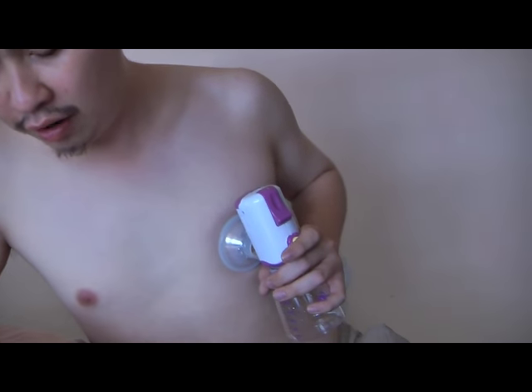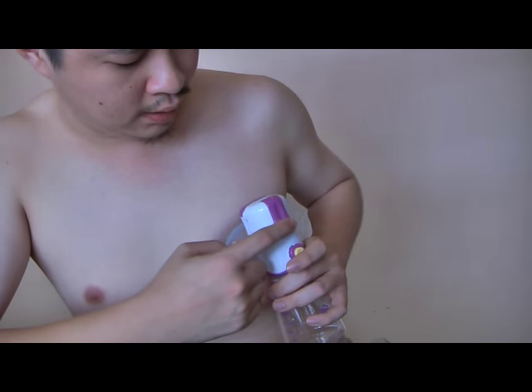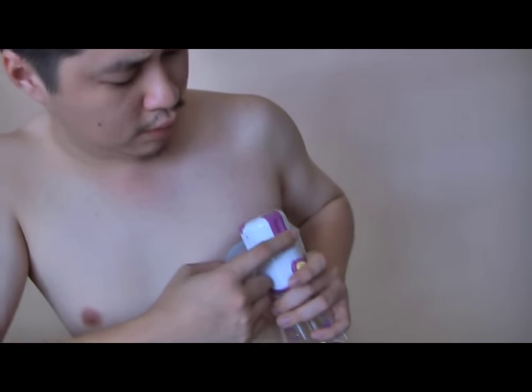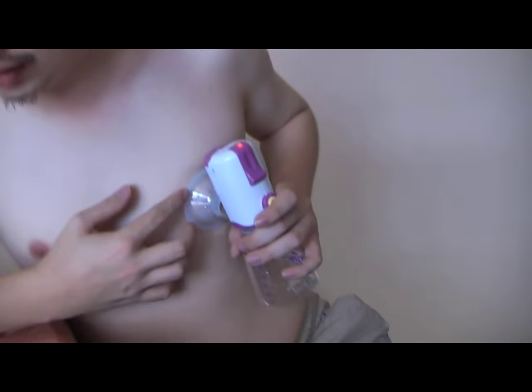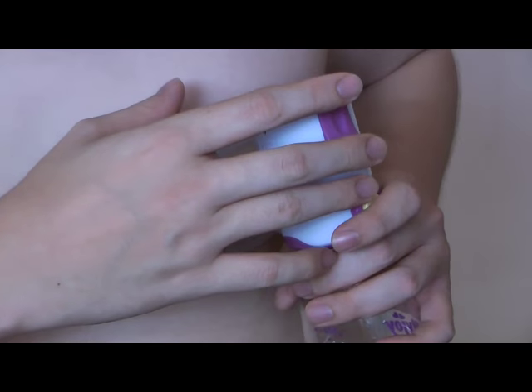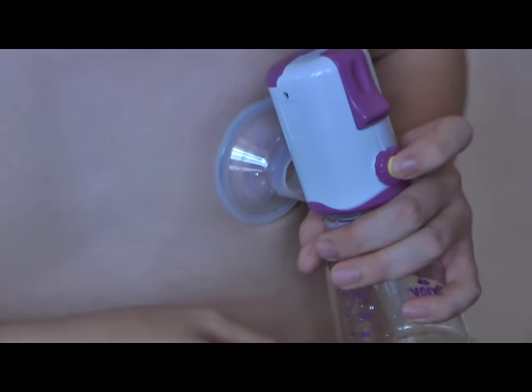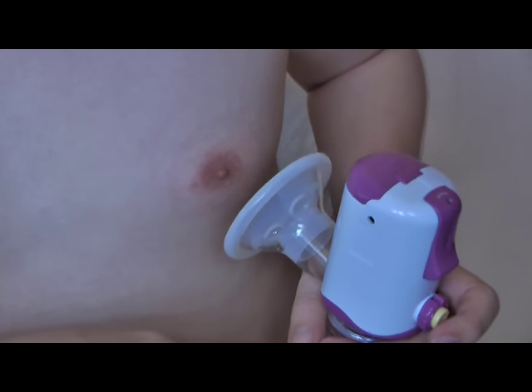Press the on/off button once to turn on the unit. The on/off button is this one. Once I press that, it begins suction. As you can see, it is beginning to suck my breast. To release, you press this button to release the suction and remove it from your breasts and nipples.